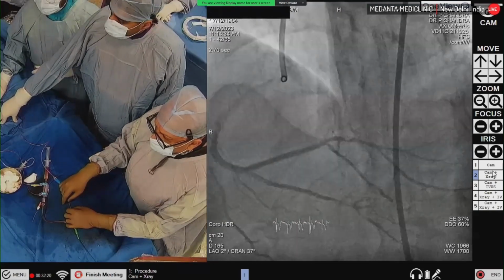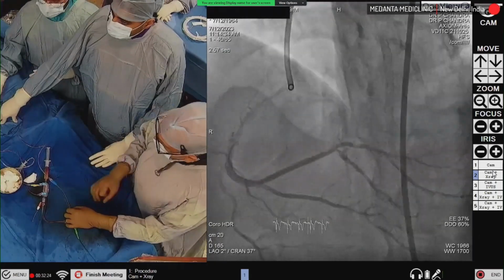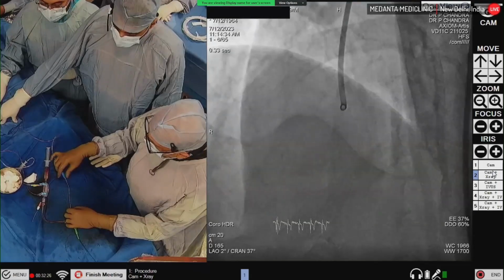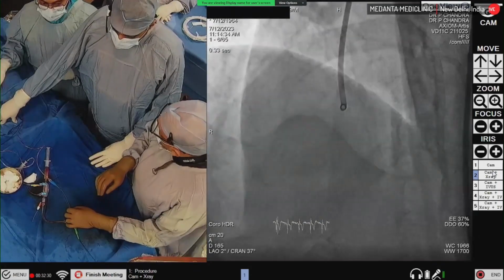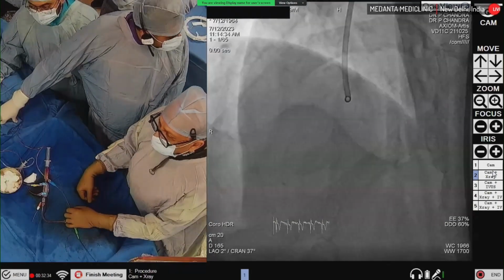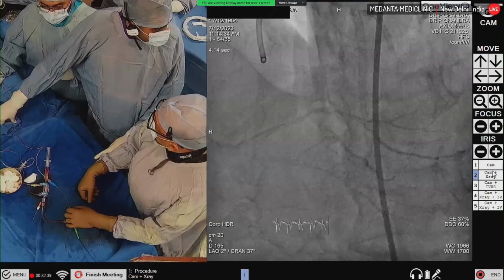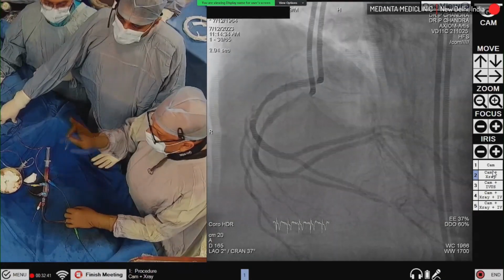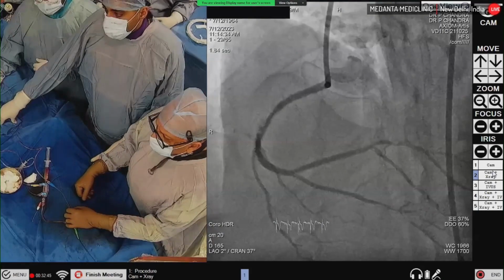Okay. So we are in presently how many? 1 minute. So this is a sirolimus eluting 2.25, 25. It's already 1 minute. Okay. Fine. And then we will slowly deflate it at the end of 1, maybe 2 minutes. Just wait. Since he's tolerating so well, why not? That's very good.